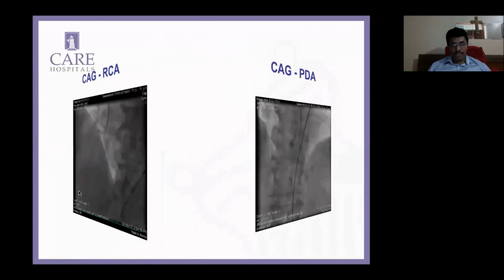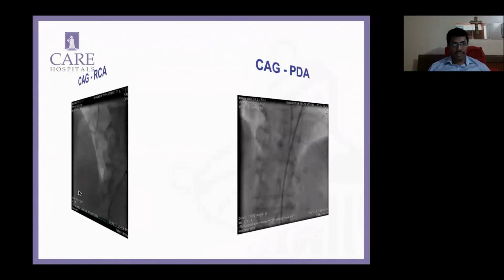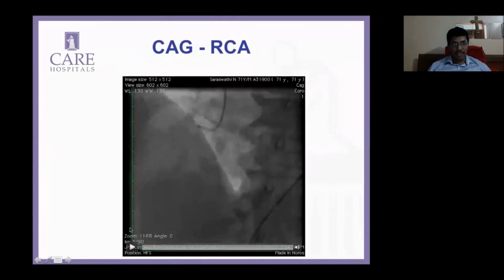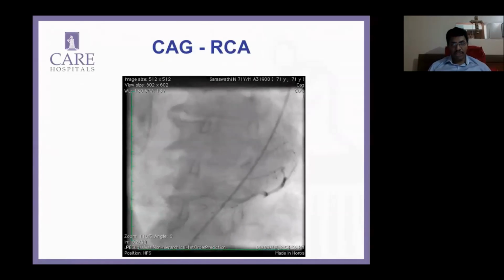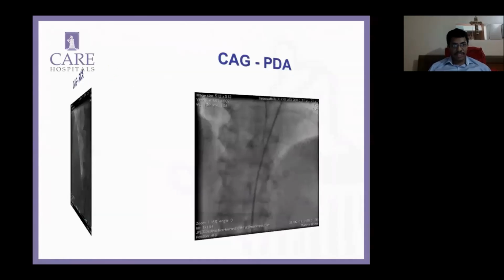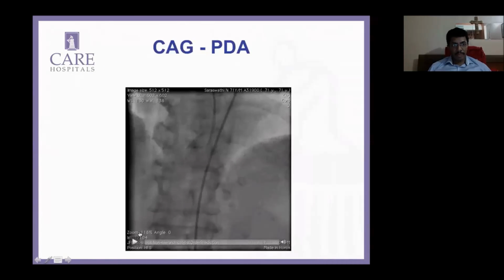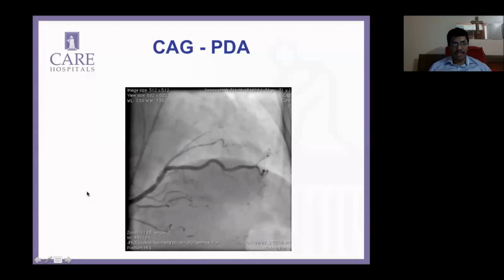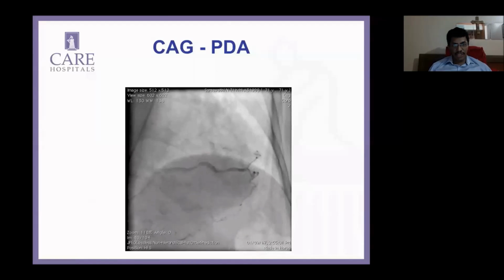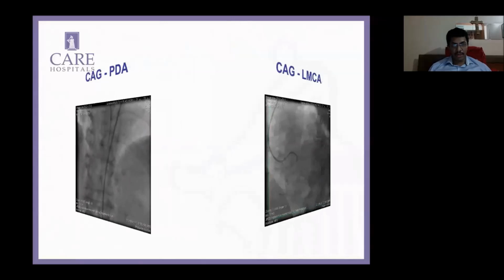So these are the images. I have the videos. So this is playing. You can have a look. This is the RCA. Pretty okay. Left system. So this is again RCA, PDA. I think there's a mild lesion distally, but we can discuss that.